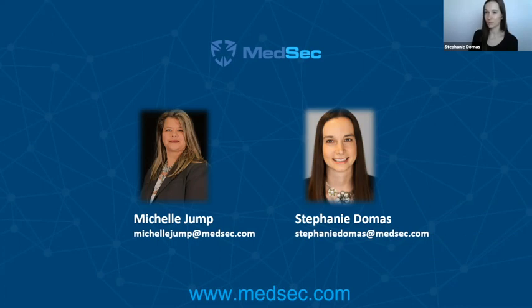And when they have new reviewers, right, they're training on AAMI TIR 57 as this is the type of thing we should be looking for. So it's kind of that universal language that if you're looking for what the FDA wants to see, AAMI TIR 57 is a good thing for you to look at to know what they are hoping to see.